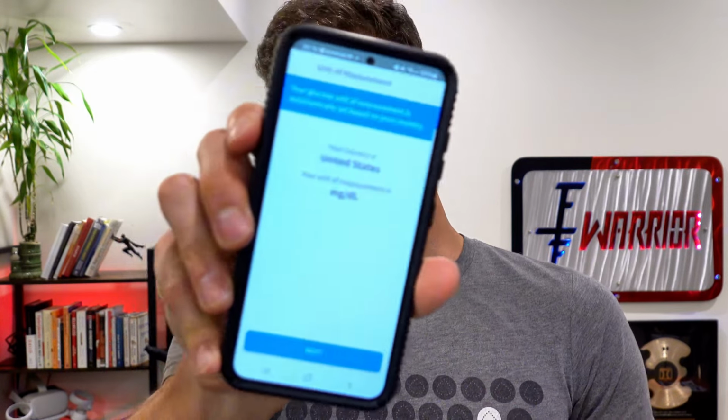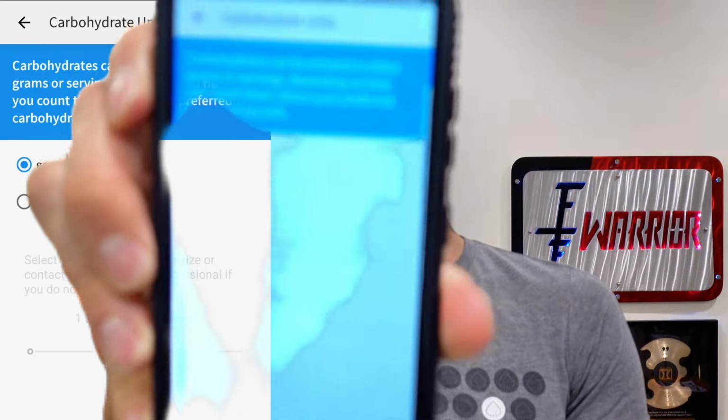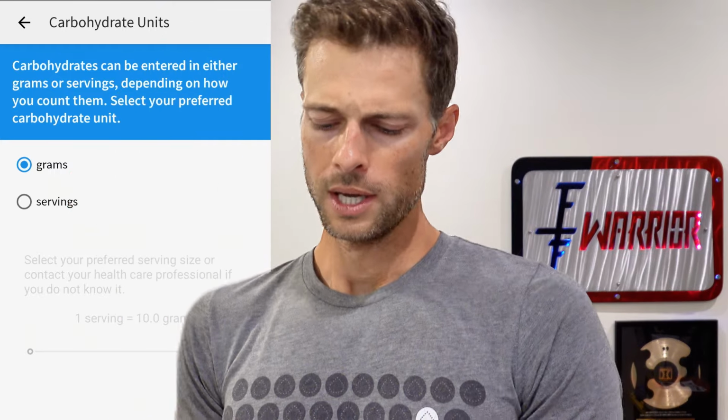So we're going to get into it. I'm going to hit next. It's going to tell me to input my data. So we're going to go in, yes, I'm in the United States. I prefer milligrams per deciliter. Other option is millimoles. And I'm going to go ahead and hit next. We're going to go in with carbohydrates being entered as grams. That's my favorite. It's more precise when offered the option as opposed to servings. Serving can vary quite a bit. So I'm going to go ahead and hit that. Grams, and we got get started.